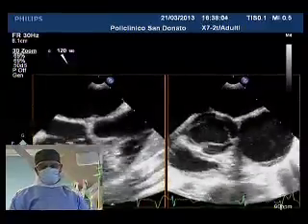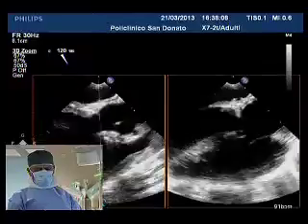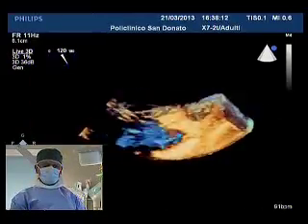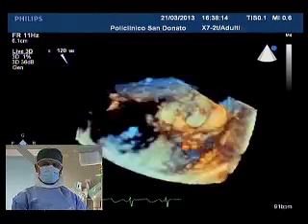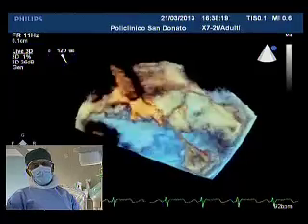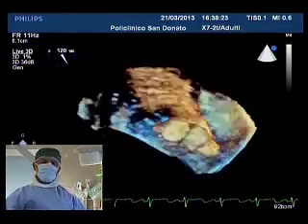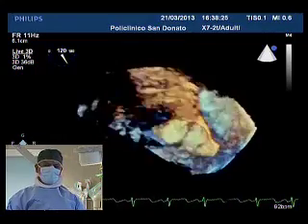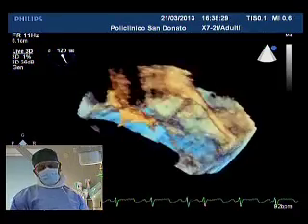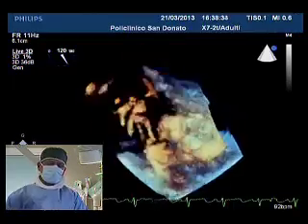The problem, again, is that you have a longer device to cross the ventricular septum, and the tricuspid valve apparatus may get interfered with. So I prefer to use a shorter device, shorter waist, similar to this membranous device. As Joachim said, maybe ideally, which I don't have experience with, is the new device. But until then, I think in select patients, you can use this device. And of course, we all have to watch for heart block, but I think it's a pretty rare incidence in this age group.